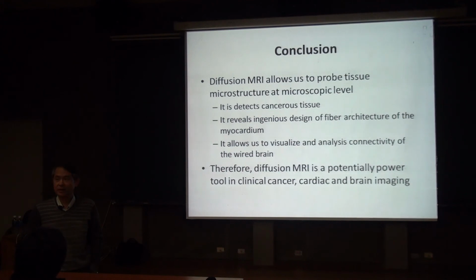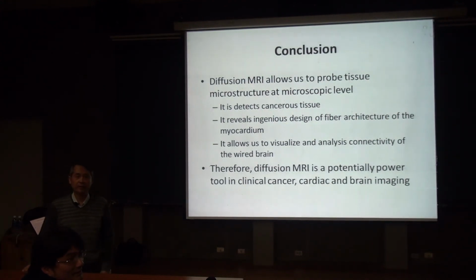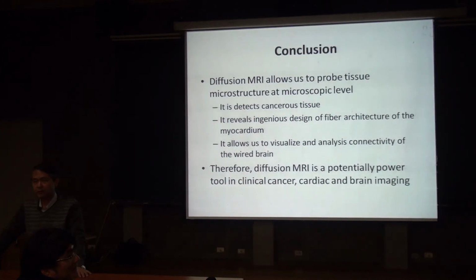It was initially developed by a Japanese researcher. He works on MRI, and he thought of this idea, and he actually developed a whole body diffusion weighted image. How long does it take? Not too long. Actually, the sequence only takes about 10 or 20 minutes.